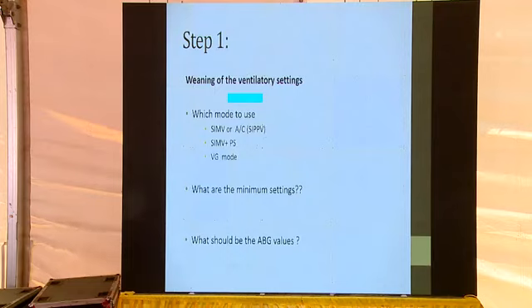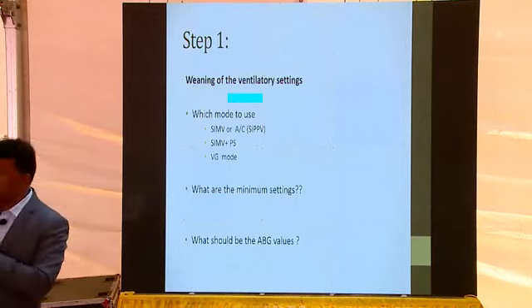But if you are giving full pressure support, like 18 to 20 pressures, it is not designed for that. Pressure support is only designed to give you a boost, but it leaves complete autonomy to the baby, without knowing whether the baby is going to breathe adequately or not. People feel that in pressure support you lose total control. It is a good mode when the baby has got better, but when the baby is a 26 to 28 weeker, just born, we don't even know the way he is going to breathe.